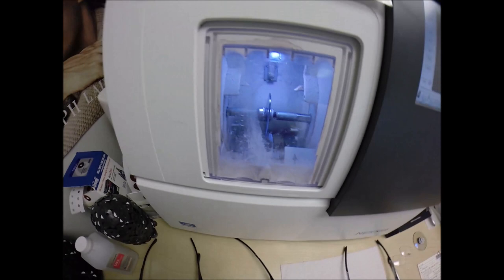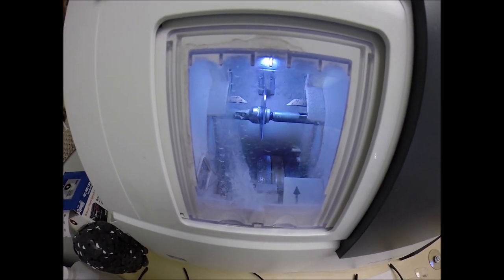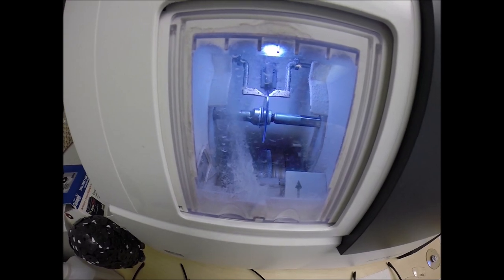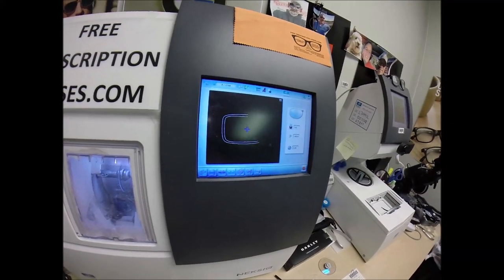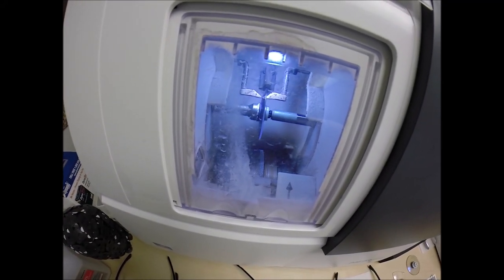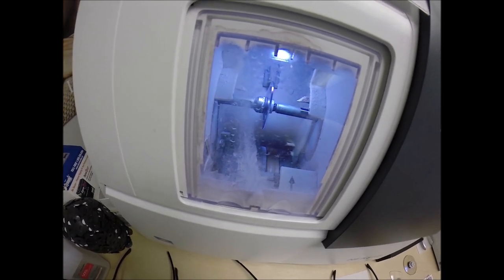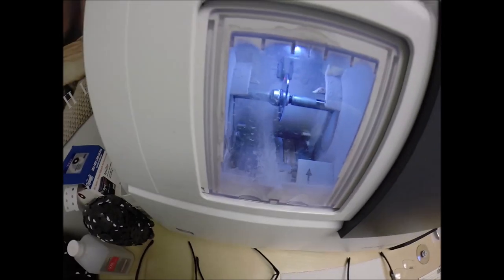So hit the start button, the door closes, the clamp shuts. The lens is going to be traced by two white styluses, making sure that it's large enough to fit into the frame. And you can see as it's going around tracing the shape of the right lens. And then the old carpenter saying measure twice, cut once is measuring the thickness of the lens at every point to know exactly precisely where to place the bevel so you have the least amount of edge thickness showing, of which we'll have none in this frame.